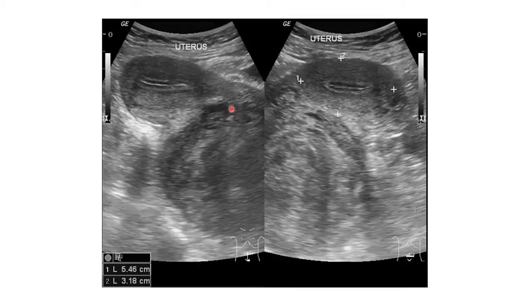So again, you can see here, this is a very giant fibroid there, and you can see the uterus there, you can see the endometrial lining there, you can see that there is a distinction between the two. So this is again a wandering fibroid or a parasitic leiomyoma, because it has lost its connection to the rest of the uterus.